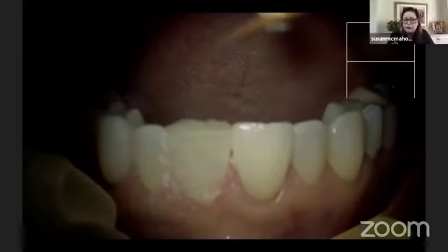So this patient comes in, you assess whether this tooth needs endodontic care or is restorable. It is restorable, it did not need endodontic care. Then we talk to her about fees. I tell her I think I can restore this with composite. I tell her the tooth next door is a little bit brighter, but she knows that. She wants to just restore it with composite, not do veneers or anything like that. We actually get her to pay right then and there, before we start work, because afterward we just want them to go home happy. So we take care of all of that.